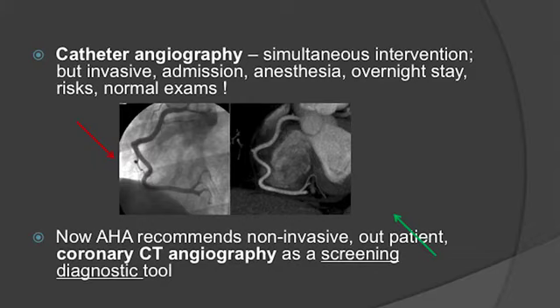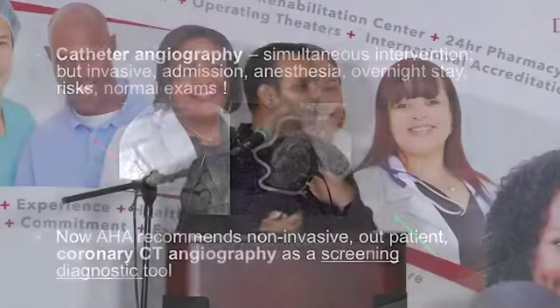As opposed to a CT angio, where the contrast is injected in a peripheral vein in the arm and not via a catheter into the root of the vessel. So there's a big difference there.